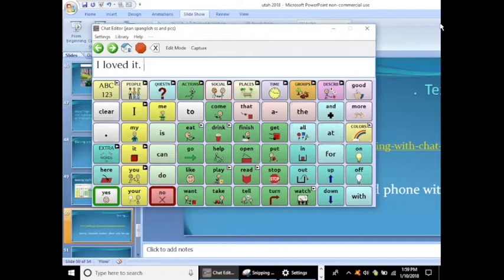Okay, if you go to Bluetooth, then you'll see that it says use with phone, right? So you just do that. And it says that it's going to go to your mobile phone. If you get charged for texting, you will get those charges. And then you just go connect to phone. So it's now connected to my phone. That's pretty cool.